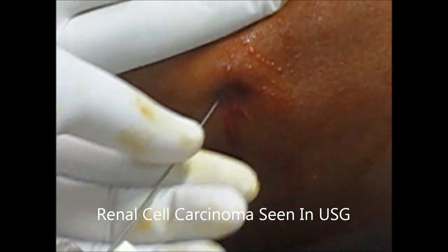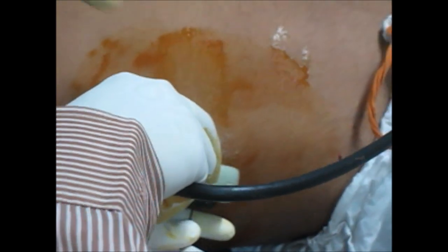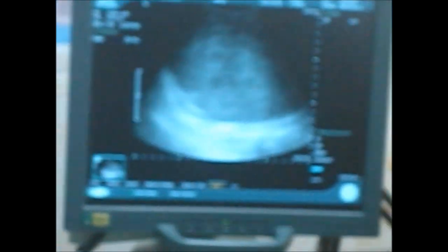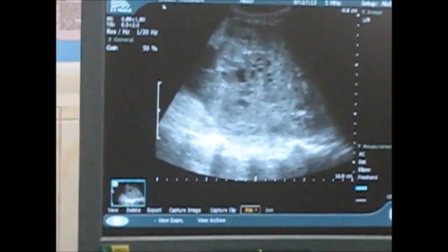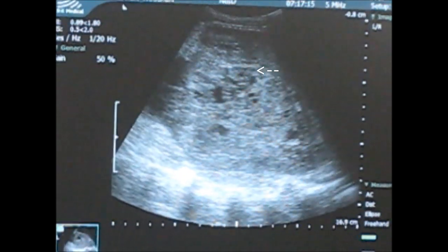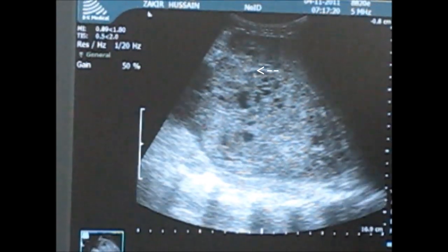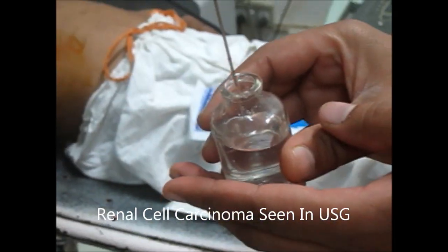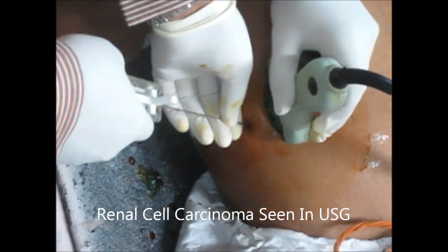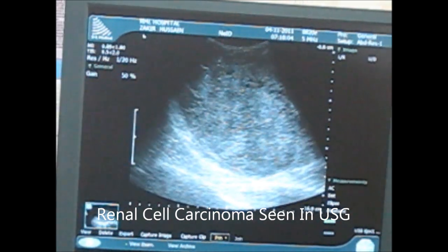Now we will insert the true-cut needle and under the guidance of ultrasound we will see where the needle is. You can see the position of the needle — you see this white area increasing as the needle is inserting into the kidney. Now we will press the button and take the biopsy.